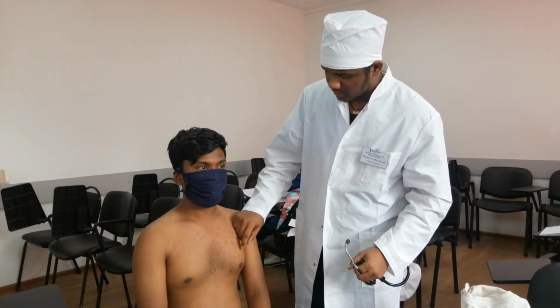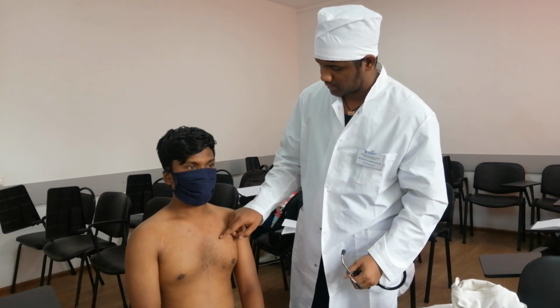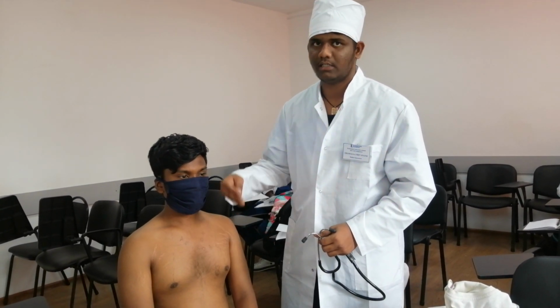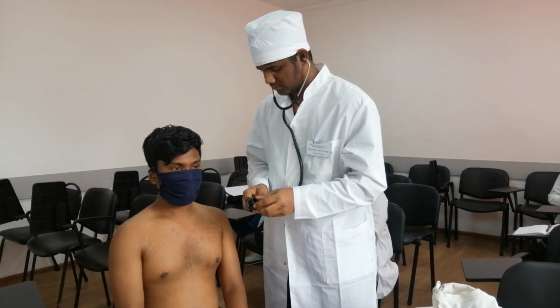Okay, next, the Erb's point. Third intercostal space, Erb's point. Okay. It is on the lower side of the aortic valve. Okay. Listen.